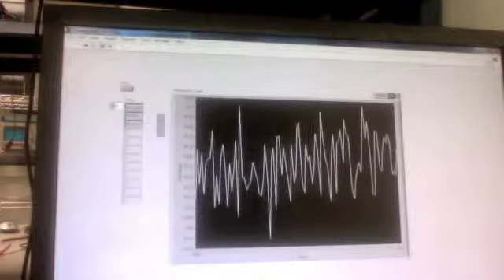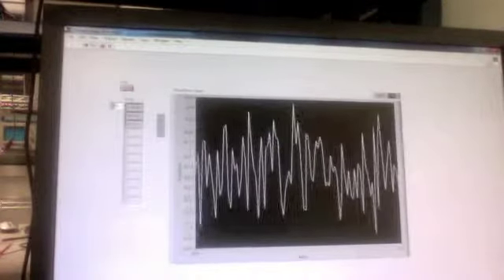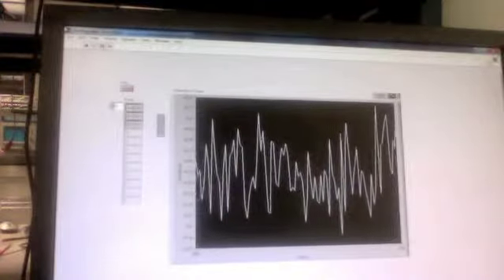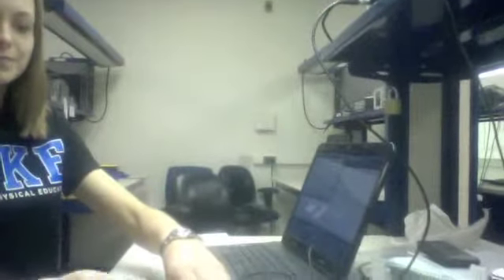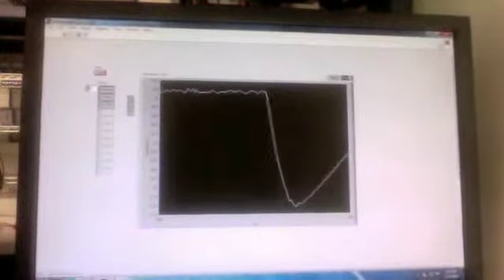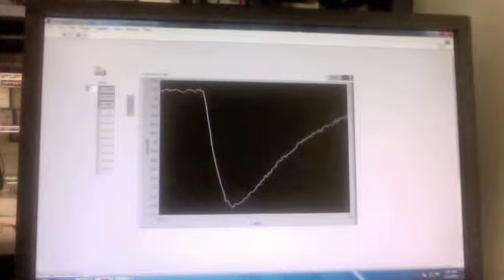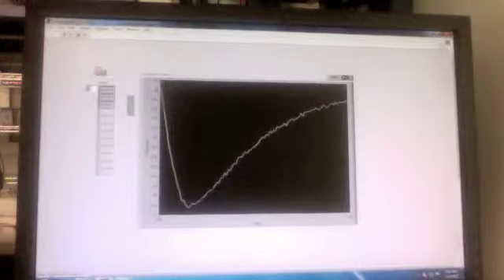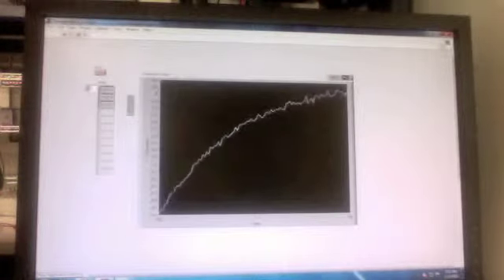Another way that we can induce cooling is with our manual input. We have this magnet here that, if swiped over the switch, would start cooling like that. Oh, and you can see that the temperature drops very rapidly, showing that it's cooling. Because our cooling cycle right now is 6 seconds, we can't really demonstrate this, but another swipe of the magnet would stop cooling as well.